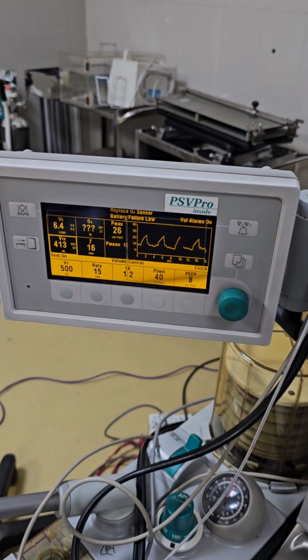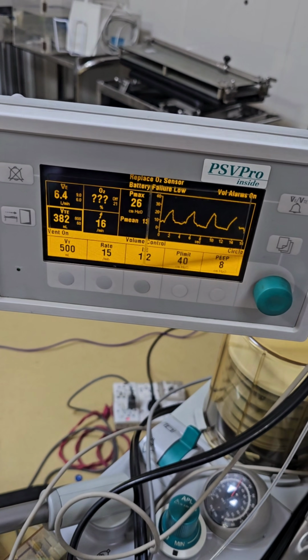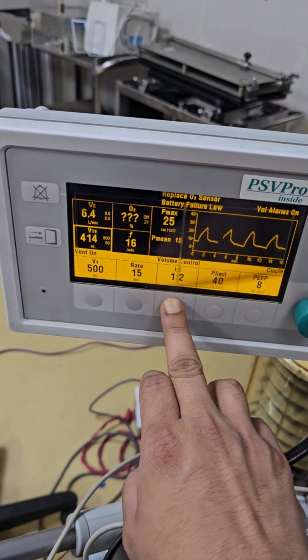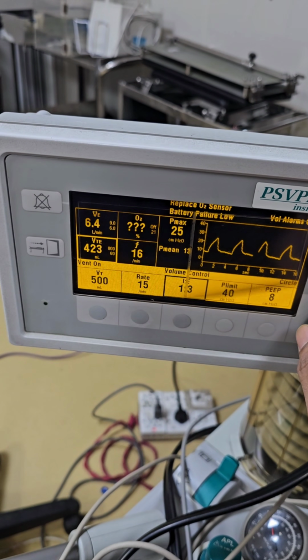And we are seeing the expiratory tidal volume is low, so we increase the expiratory time. That means we reduce the I:E ratio to 1:3, maybe to increase the expiratory tidal volume.